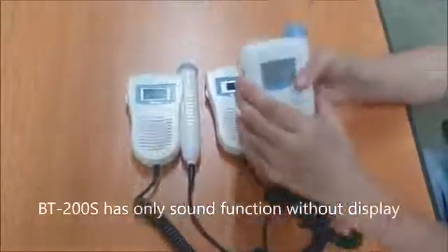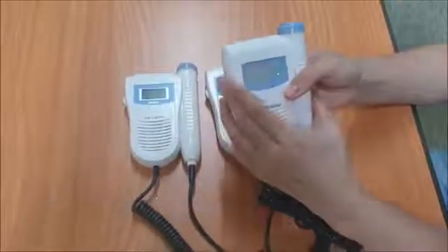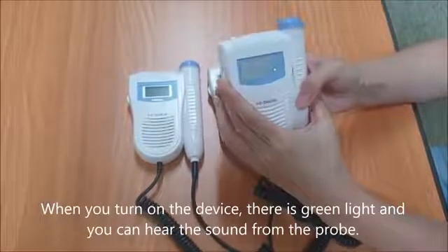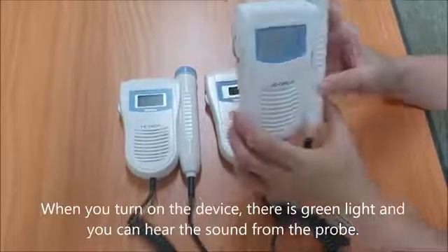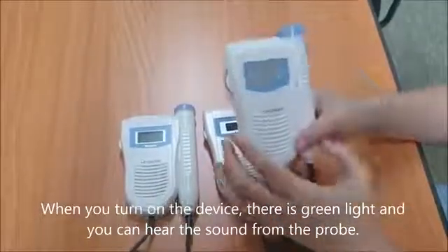BT200S has only sound function without display. When you turn on the device, there is green light and you can hear the sound from the probe.